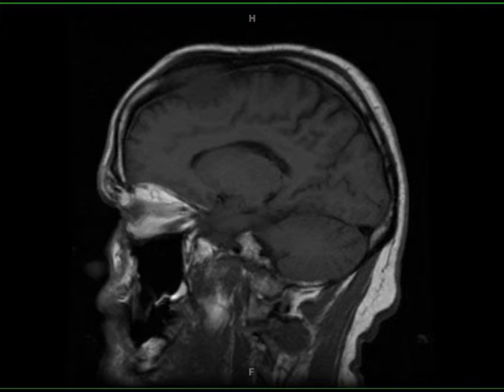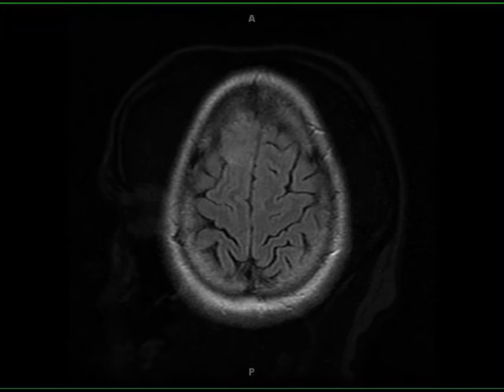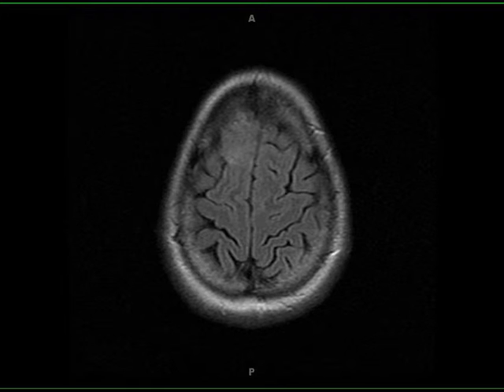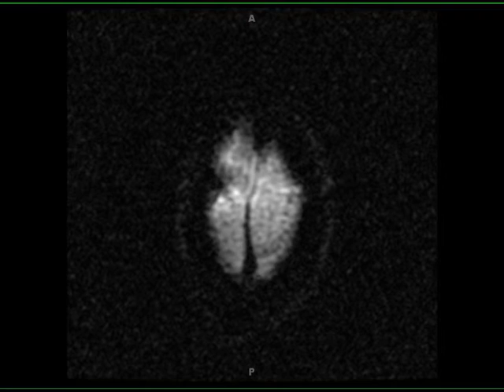These images demonstrate a partially circumscribed infiltrative T1 hypointense, FLAIR minimally hyperintense mass centered in the parasagittal right frontal region with mild effacement of the superior right frontal gyral parenchyma. The lesion demonstrates moderate diffusion restriction, and on post-contrast images, there is enhancing tissue extending into and through the right frontal bone to the subgaleal space. There is associated linear dural thickening.